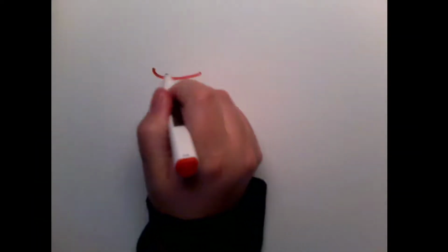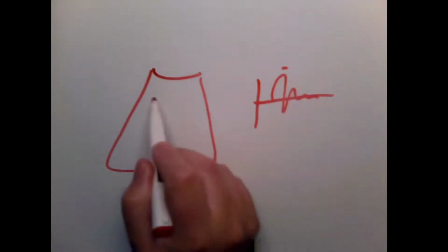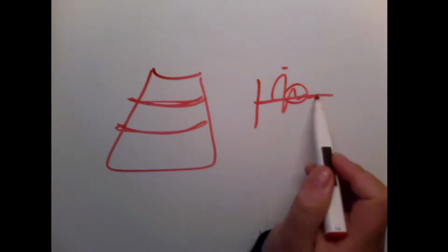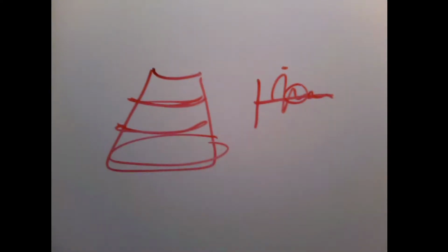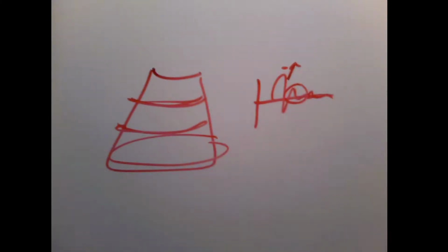So again, if we have our image here and our pulse is sent out and we kind of have something like that, we're going to use our high frequencies for this first section here. We'll use our middle frequencies to get information from the middle section, and then we'll use our lower frequencies for the far field. The beamformer is responsible for kind of understanding how these frequencies are coming back and listening for it. Again, way beyond the scope of what you need to know, but know that dynamic frequency tuning utilizes the different frequencies emitted by the transducer to process different levels of the picture. And the beamformer and receiver both play a role in how those echoes are processed.